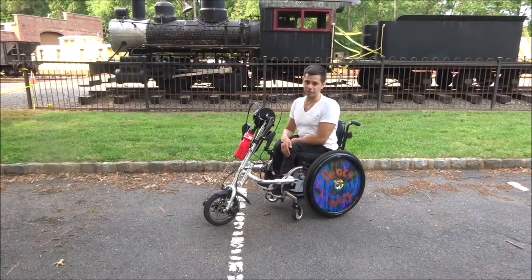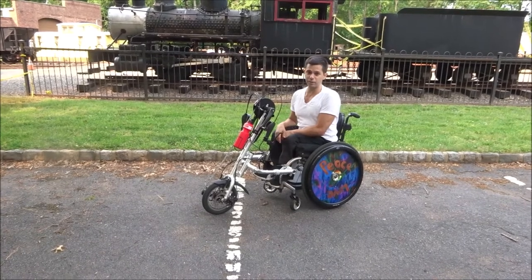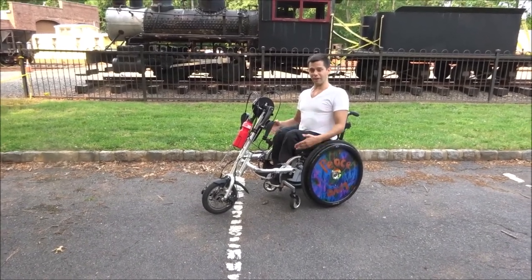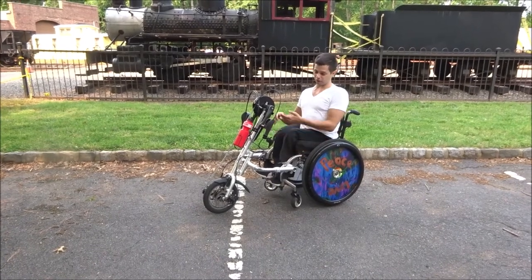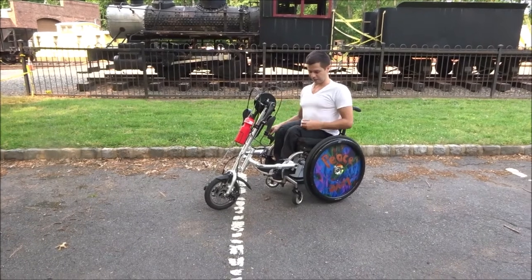Hey again YouTubers, I've got another video for you about the Dragonfly wheelchair attachment. I realized that I forgot to show you how to get it on and off — or well, in the case of this video, off and back on — so I'm going to do that right now.